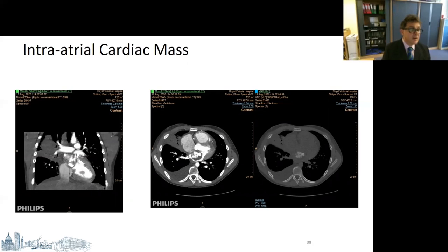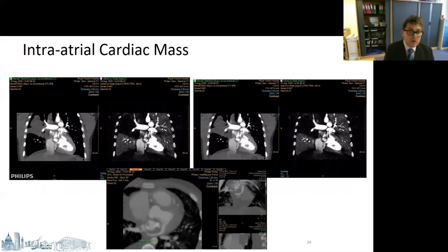The patient was referred for cardiac CT and was performed on the spectral scanner. And as you can see, the virtual non-contrast study confirms the presence of calcium within this lesion. But there is more. Reviewing the spectral data shows a significant perfusion defect within the lung parenchyma. The right PA does not show any occlusion, as you can see. However, there is significant compromise of perfusion, and what was noted is a problem with the right upper pulmonary vein.